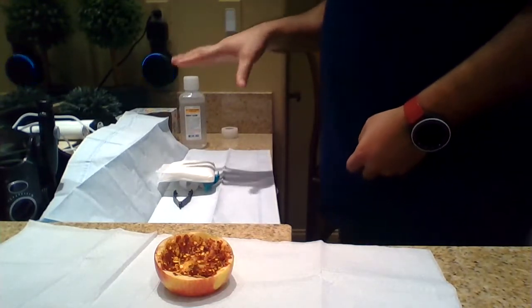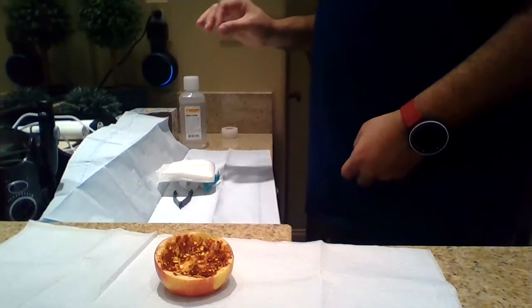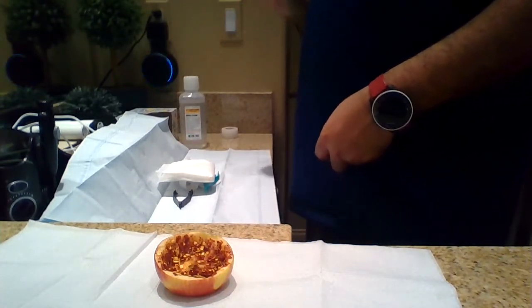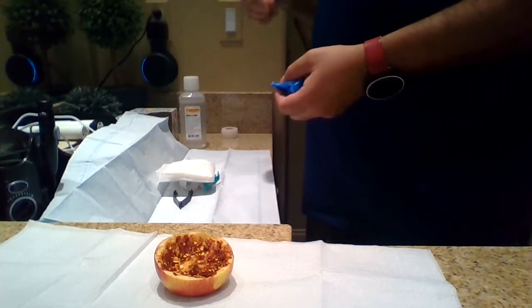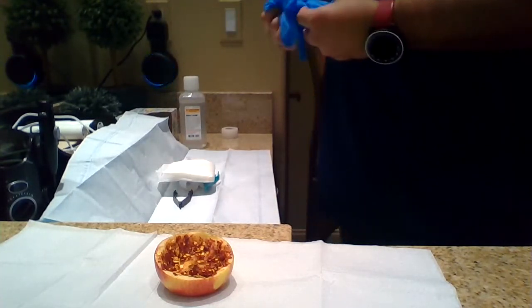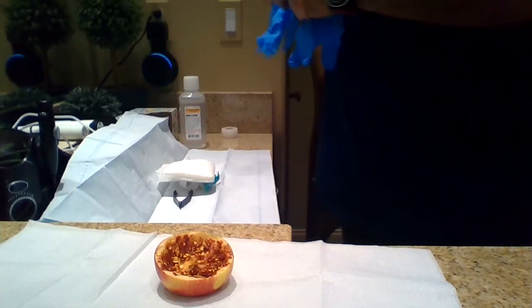So now everything in the center is clean. Again, I can't turn my back, and I can't cross-contaminate by having something hover over it. I gotta keep my 1-inch borders in place. So now I'm gonna don my sterile gloves.